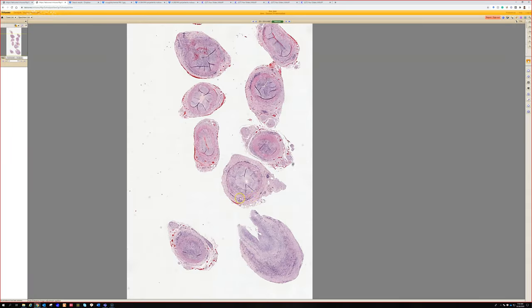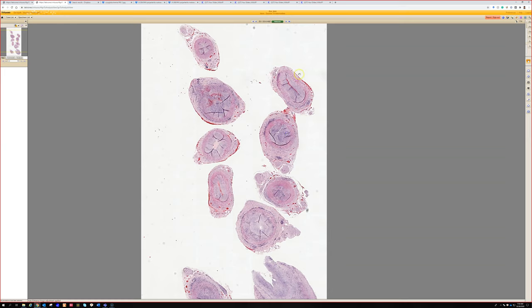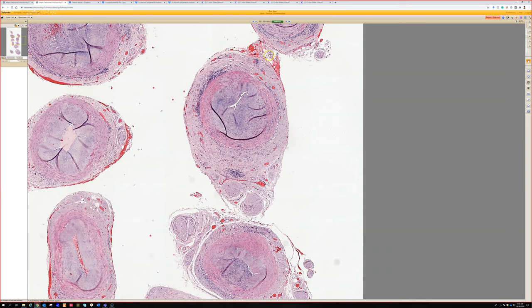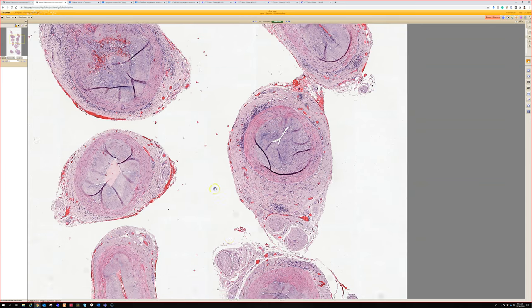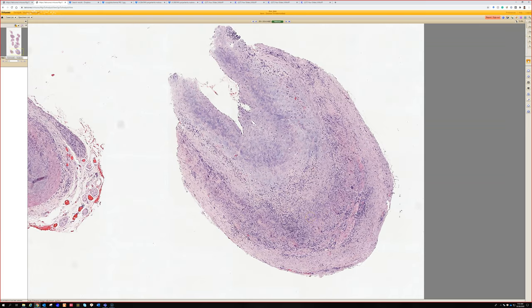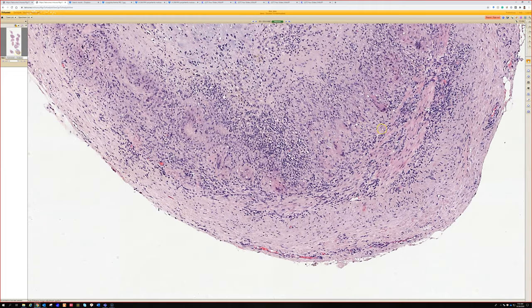This is a great case — one I rarely get to see. This is a temporal artery. It's the only thing I feel like that looks like this — it may come onto the dermal test. It looks like a true artery — it's nice and round, it's got a really thick muscular wall, in a kind of leaf-like fashion. Normally these biopsies are looking for giant cell arteritis — looking for inflammation and degradation of the internal elastic lamina.